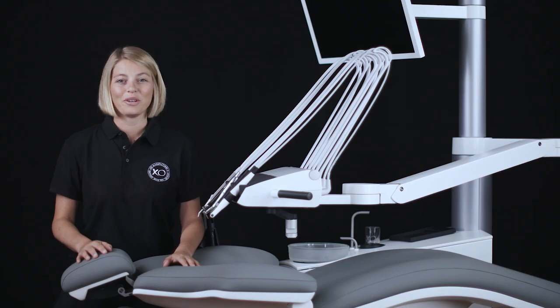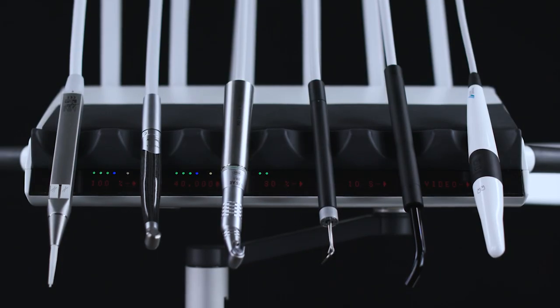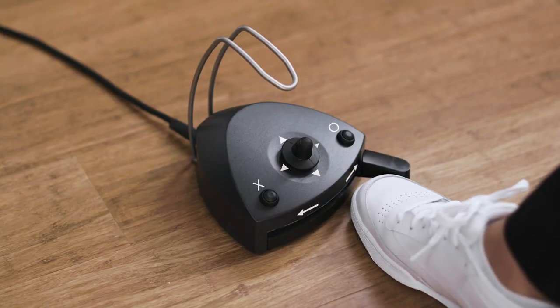In this video tutorial you will learn about the functions and correct operation of instruments using the foot control pedal. Up to six instruments may be fitted to the instrument bridge. The instruments are numbered one to six starting from the left. Data about the selected instrument is shown on the instrument bridge display and the instrument may be controlled using the foot control.